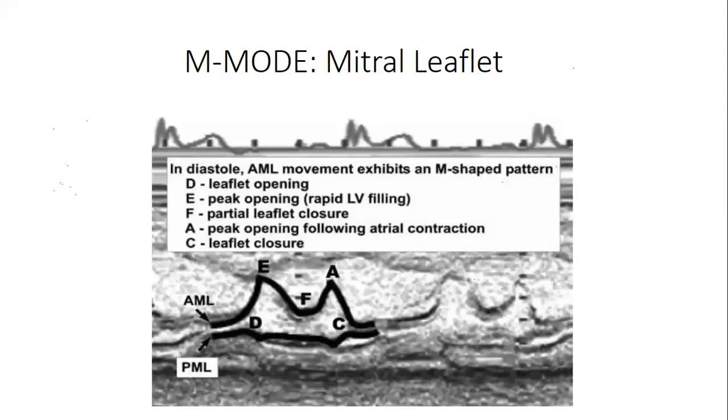Okay. Just a few things that you need to understand. These things we will still be repeating, but I just want you to be comfortable with certain things. So when you put your M mode on the mitral valve leaflet, you are going to have something like this.